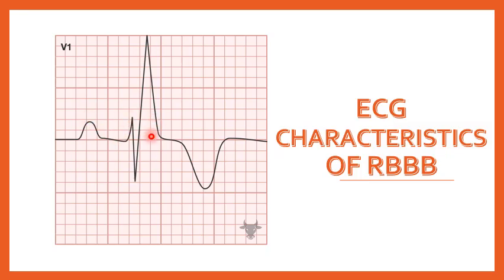And we know it's a right bundle branch block because you look at, first of all, the width of the QRS complex to determine that there's a bundle branch block. So is the width of the QRS complex 0.12 or greater? And yes, check, we're there, roger that. And then we look at the configuration in V1 to determine if it's left or right. And we can certainly see here RSR prime configuration and right ventricular strain pattern, which is causing the tipped over T.